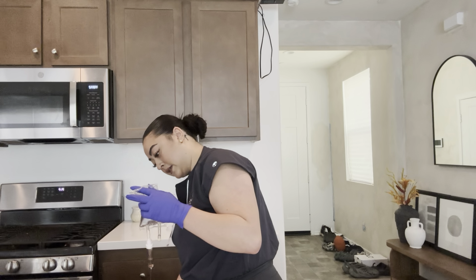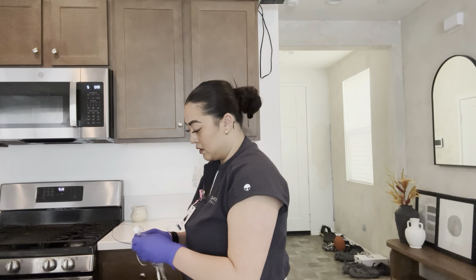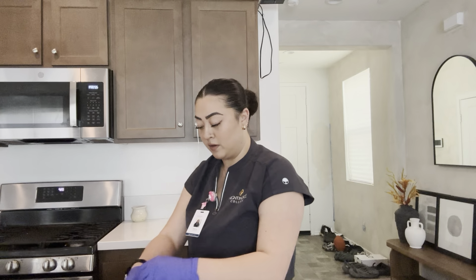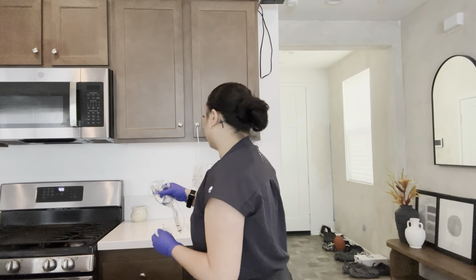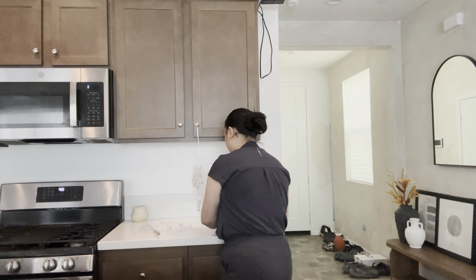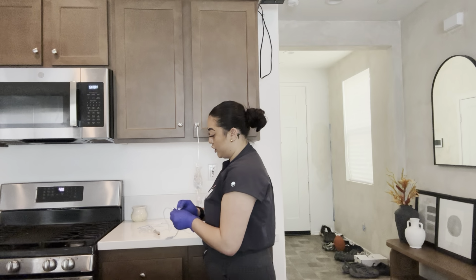Beautiful, everything looks good. Gonna put the cap back on for just a moment because I'm gonna need to wipe down the Y port, which is where we are going to attach that part so that we can administer the medication.